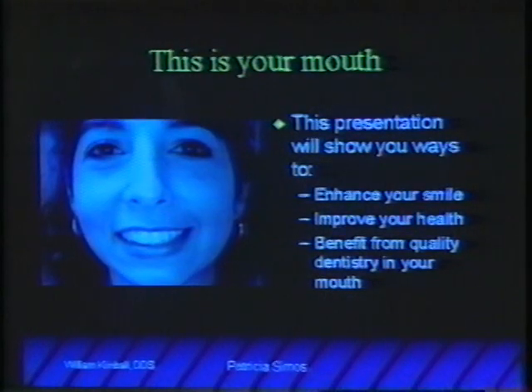First, notice the initial slide has a photograph of the patient along with information that pertains to the patient. The doctor's name appears at the bottom of all slides, and the patient's name appears at the bottom of all slides. This allows the patient, when she first sits down, to realize that this presentation was personalized for her.